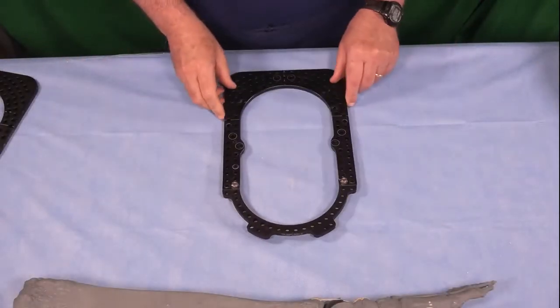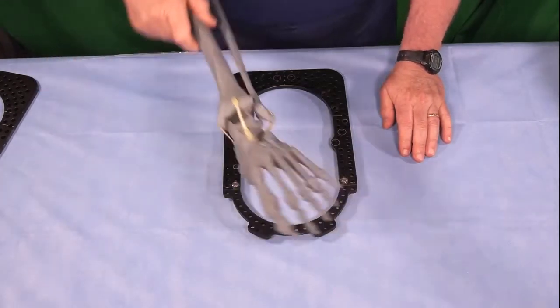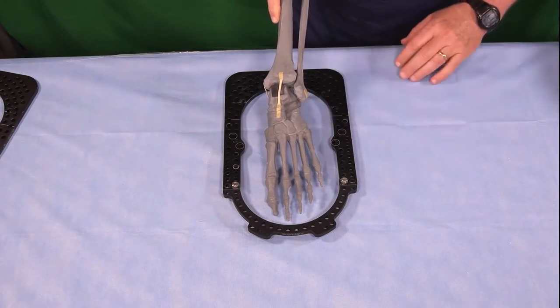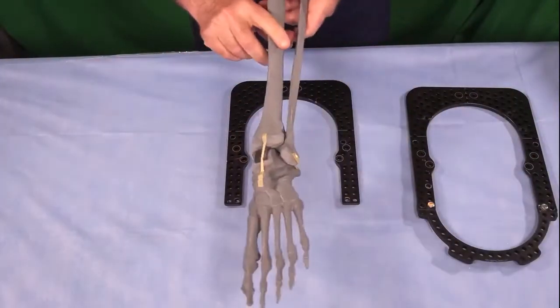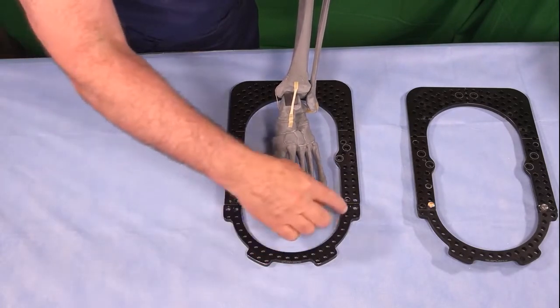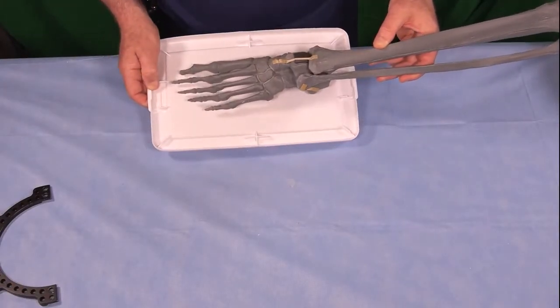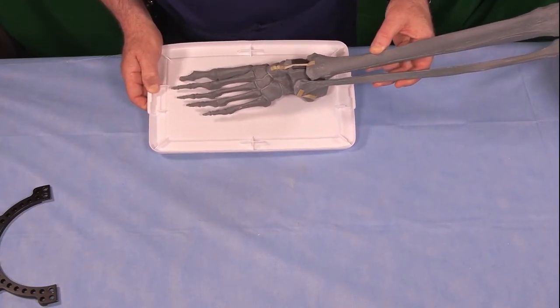This is a foot ring that's been closed off for additional stability, and our foot will fit within that. But as you'll see in a few minutes, when we put the wires in and put the rings on, it's more useful to mount the ring open, and once the ring is mounted, then we'll add the foot half ring to close it. I'm going to mount my wires on this foot so that they're parallel to this cutting board surface. And then once the wires are in, then we'll add the ring that goes with it.